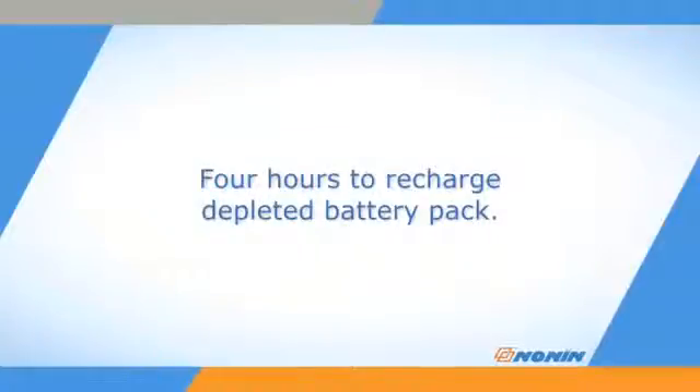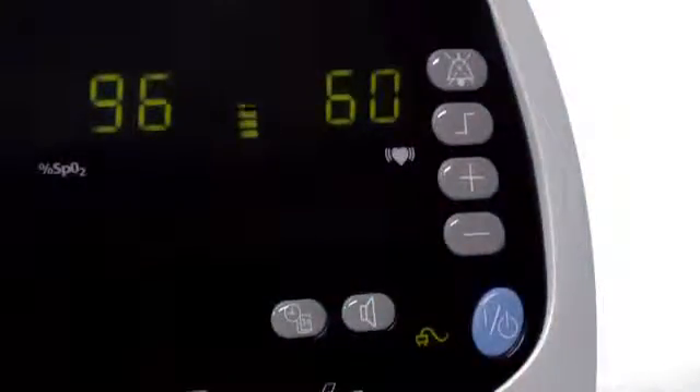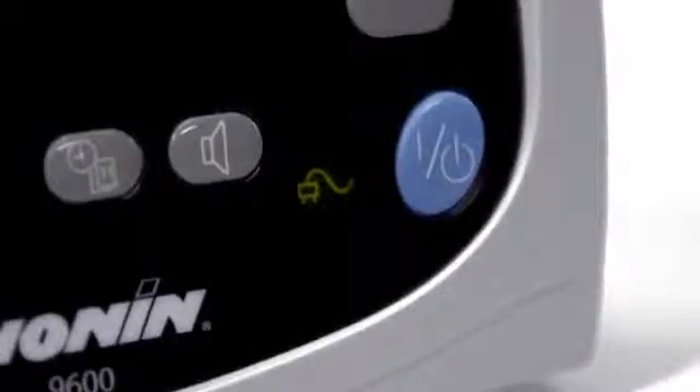Recharging takes about 4 hours when the battery pack has been completely depleted. The battery level indicator displays even when the oximeter is running on external power. With the oximeter running, momentarily press the on-off button and the pulse strength bar LEDs will display the battery charge. Amber represents depleted capacity and green indicates available battery capacity. The battery will charge while the oximeter is running on external power.